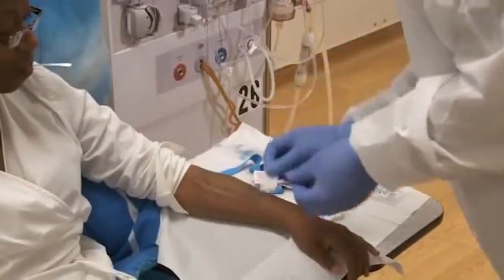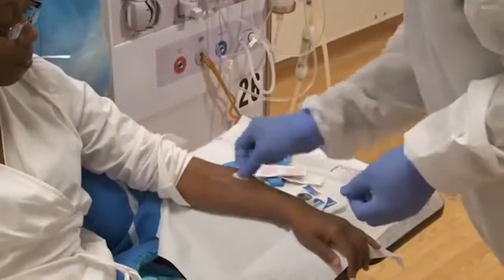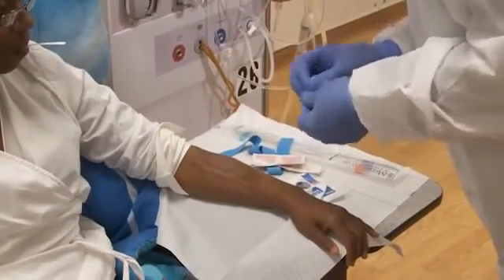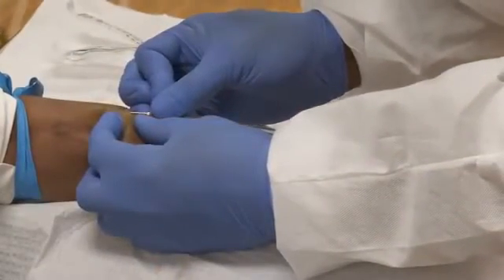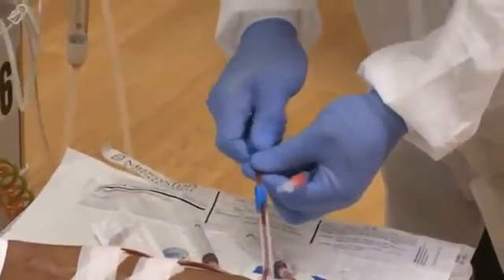If the site is clear, apply skin antiseptic to the site and allow it to dry. To maintain aseptic technique, let the antiseptic air dry naturally and do not touch the clean site. Perform cannulation and be careful not to contaminate the area that has been cleansed. Secure the needles and connect to the blood lines using aseptic technique. And remove gloves and perform hand hygiene.